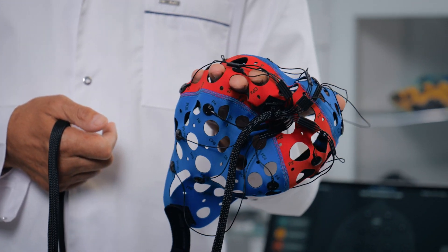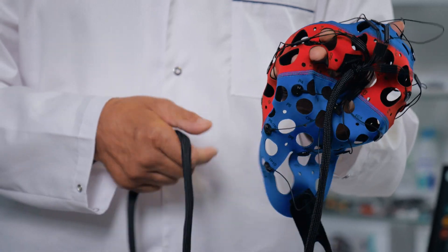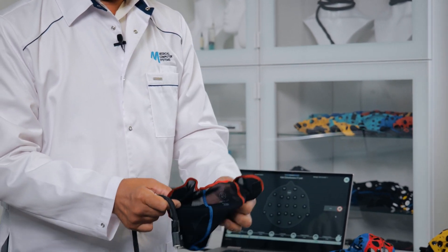Since we are conducting long-term monitoring, it is recommended to utilize electrode paste for this particular model. Upon wearing this cap, we need to secure it with a special fixing helmet to ensure proper fastening and protection.